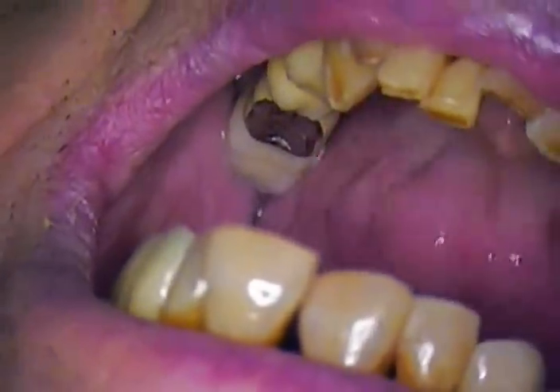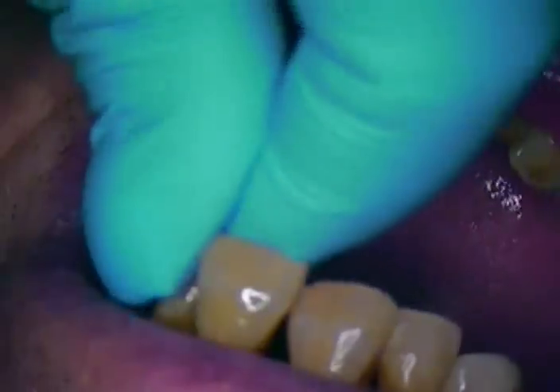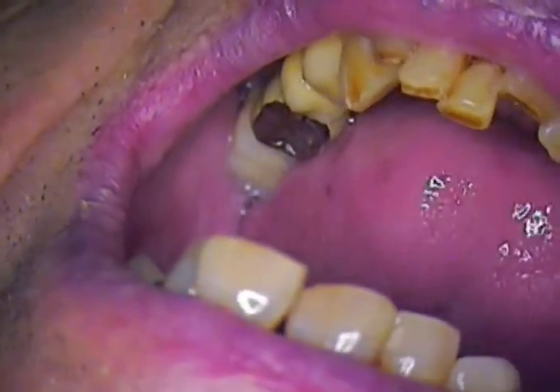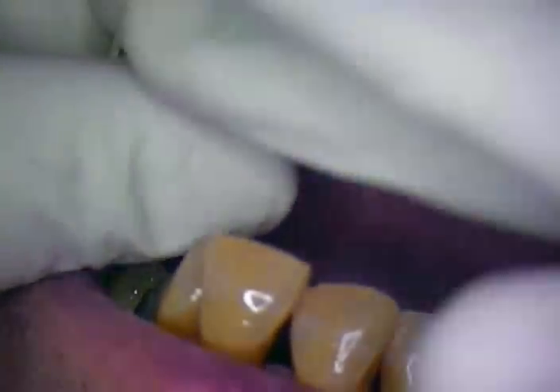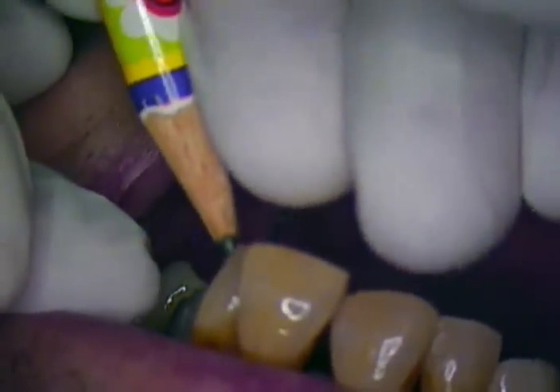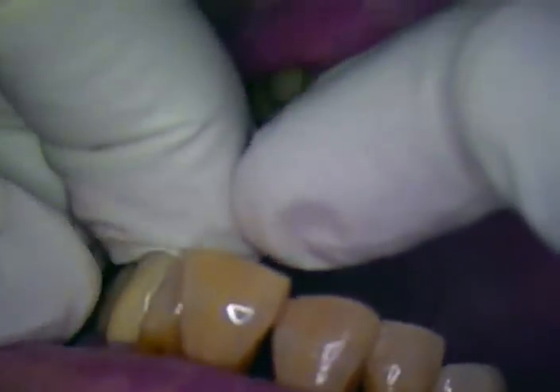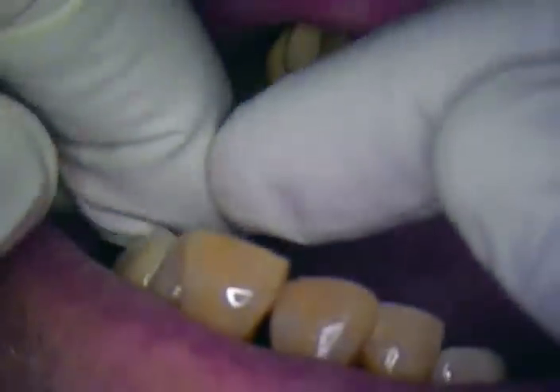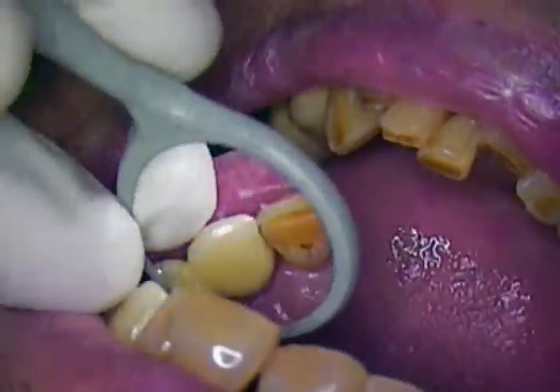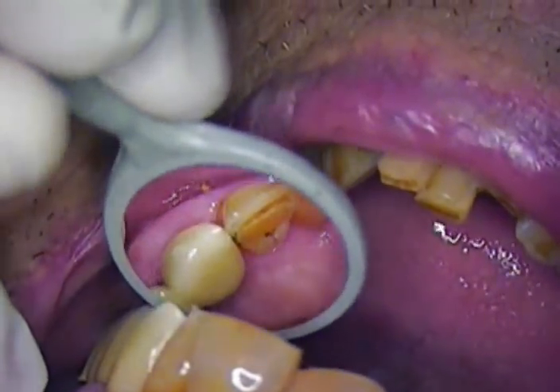You feel a little tightness in the front, Joe? Yeah, just right up here in the front. So we're going to mark it with a little graphite right now — I'll dry off the tooth. This is a really highly glazed surface, so I'm going to place just a little bit on the corner, and a little bit will come off onto the mesial surface of the bridge. Usually what that is, is some glaze. We went right from a framework try-in to a glaze — we did not have a biscuit try-in, so I don't know what the occlusion is going to be like until we check it.